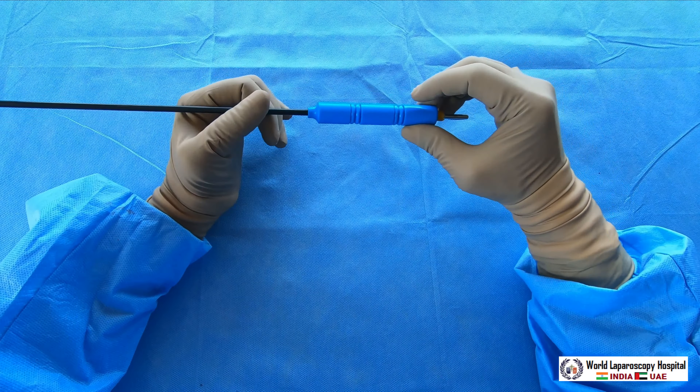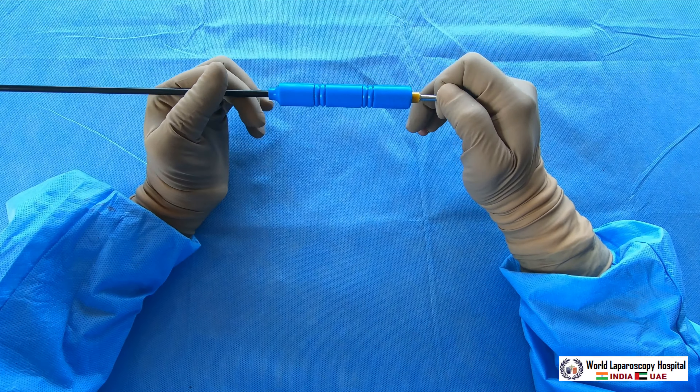This is a very simple but useful instrument used in laparoscopic surgery — the laparoscopic spatula. Thank you very much for watching this video. Have a nice day.